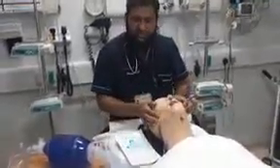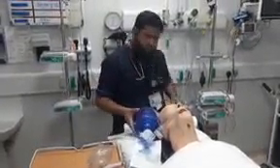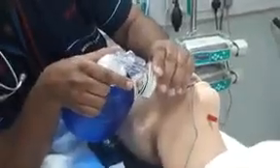Then you tie or fix the tube, attach the ETCO2 detector, and attach the BVM bag connected to oxygen. You can see the chest is rising. The ETCO2 detector has three colors — blue, green, and yellow. It should also be connected with capnography as well.